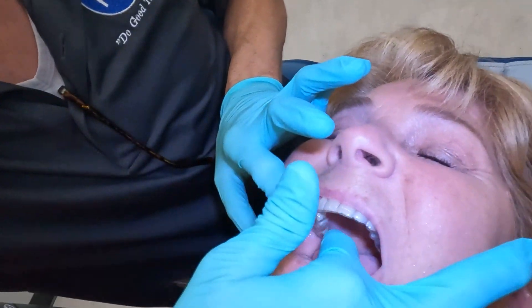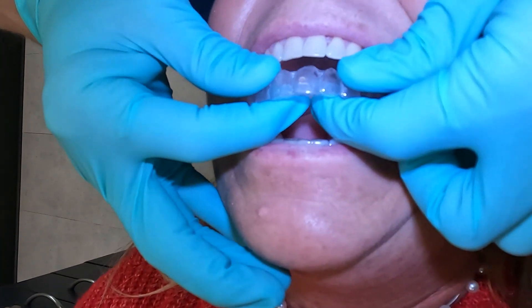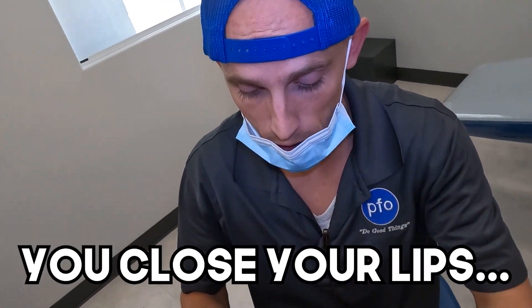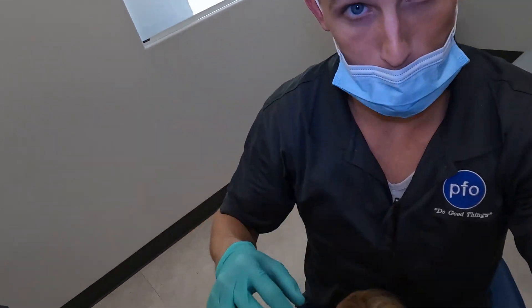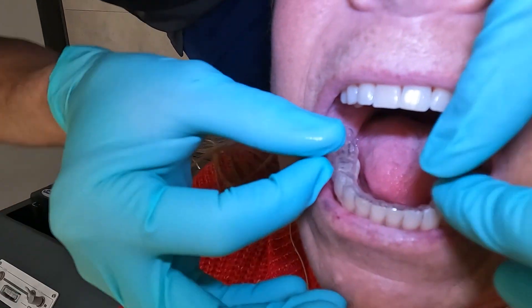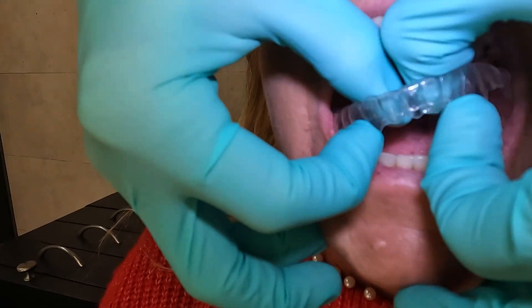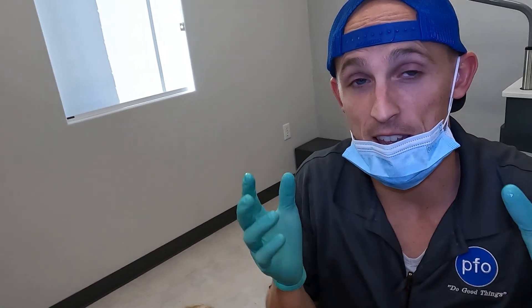You get your finger way back there and pop it down, then work it out all the way around. If you're out in public wearing this all the time and taking it out, before you pull it all the way out, close your lips and kind of suck all the spit off the retainer as you pull it out. For the bottom: find a spot, pull, get it to pop up a little bit, and start working around. If you've got plastic next to a missing tooth area, don't bend it too much because it'll break — work it out gently.